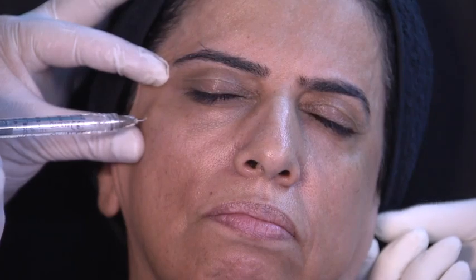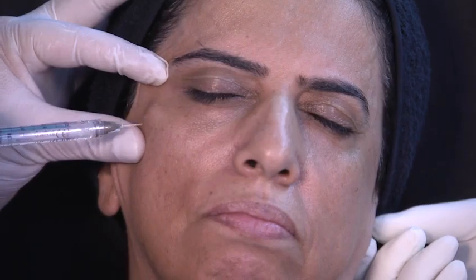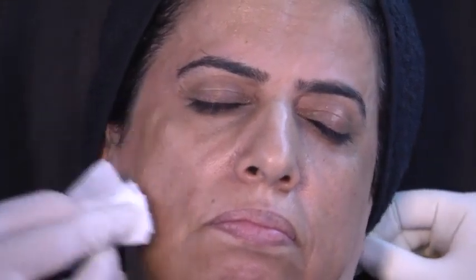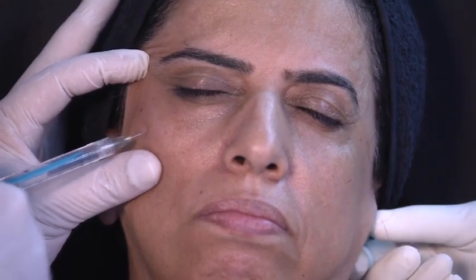So, relax, okay? So, stretch the skin, first point, lateral zygomatic arch. You can see that immediately, we can see the bolus. Look at that. I can immediately see an exaggerated bolus. When I see my exaggerated bolus, I stop. It has to be exaggerated. If not, I will lose the projection when I mold. So now look at this exaggerated nodule and everyone is, oh my God, what is he doing? This is OBT, easy to mold and shape, okay?